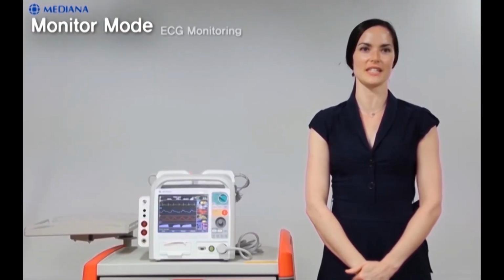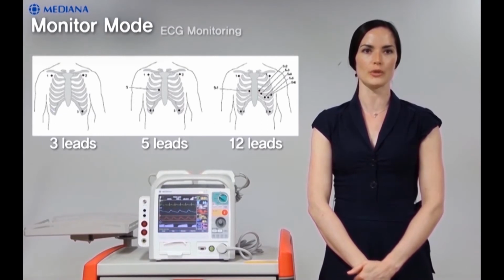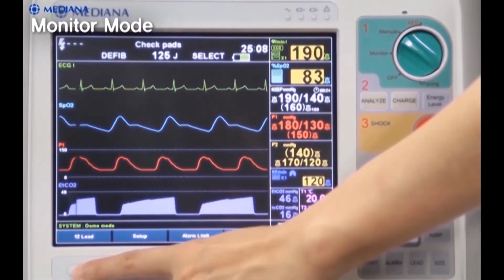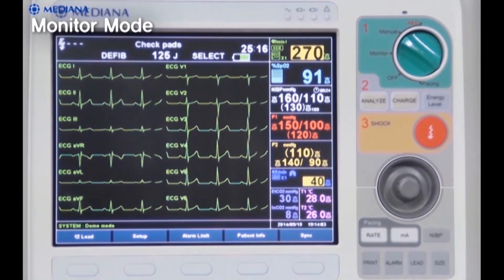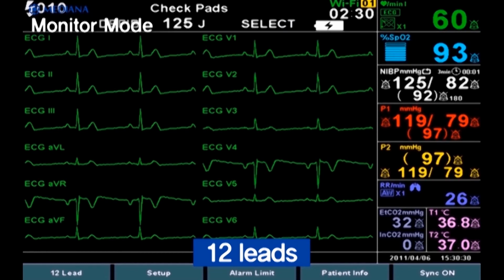Let's take a look at the ECG monitoring. The D500 can use 3 leads, 5 leads, or 12 leads for ECG monitoring. You can see how to place the electrodes from these illustrations. Now, let's see how to activate 12-lead ECG monitoring. Press the 12-lead soft key located in the lower left corner of the screen and press the Acquire soft key to acquire the 12-lead ECG data. Then, press the 12-lead on soft key to set the 12-lead display. Here you can see how the ECG waveform display is presented on the screen.